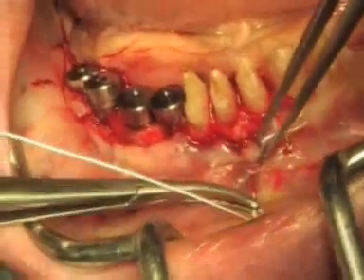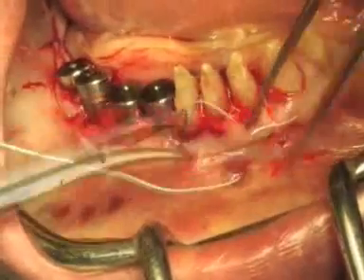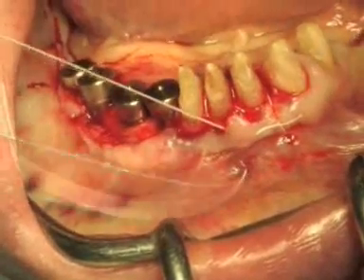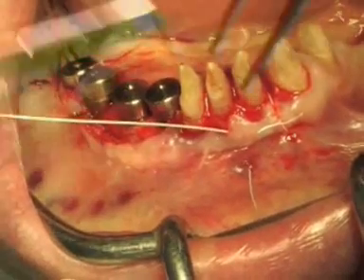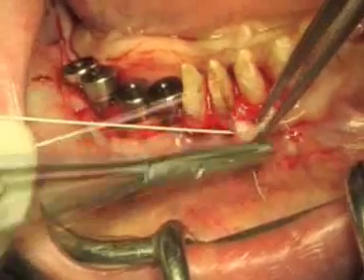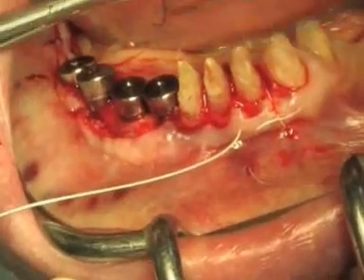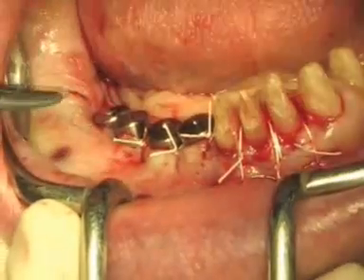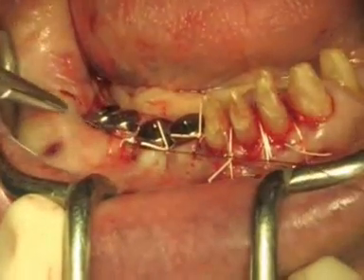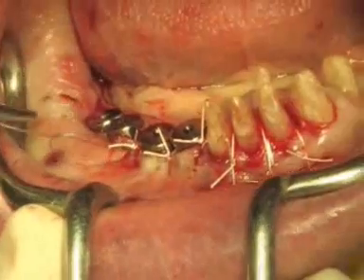As it is already possible to see, the difference in level between the gingival margin at the level of the implants and the level of the natural teeth is in favour of the implants. This is expressly sought during the healing process. The tissue will recede apically at the level of the implants, whereas it will grow coronally at the level of the natural teeth. The suture is completed to obtain good adaptation of the gingival margin around the implants for coronal positioning of the flap.